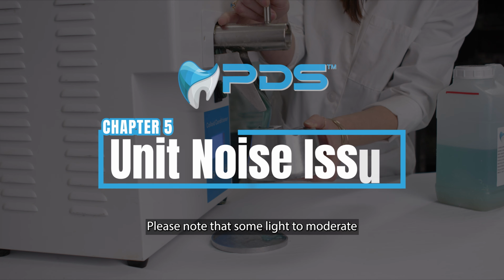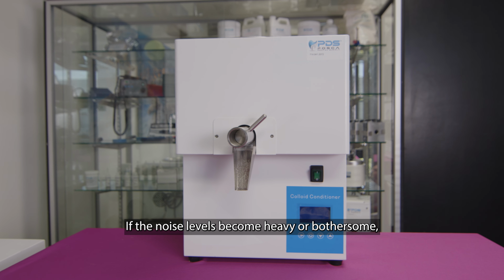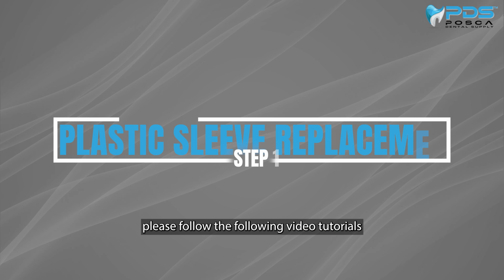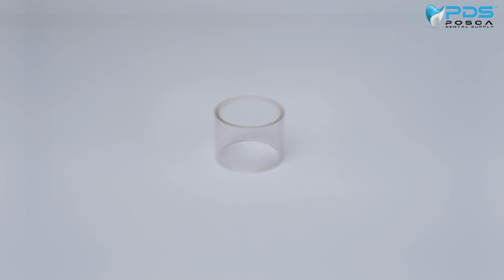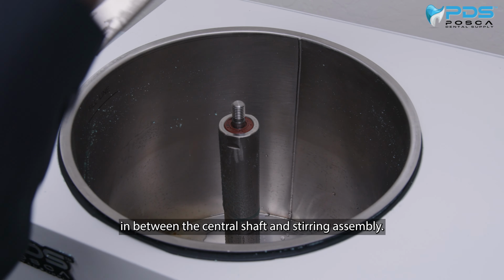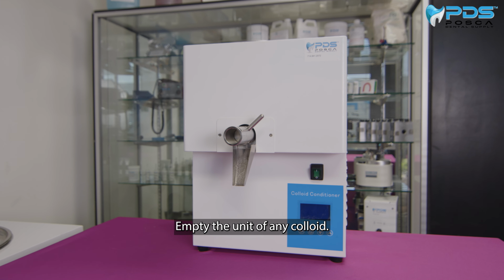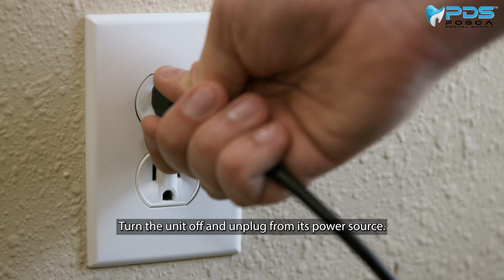Please note that some light to moderate noise is normal when the unit is running. If the noise levels become heavy or bothersome, please follow the following video tutorials to remedy the issue. The first line of action to remedy the noise issue is to check the plastic sleeve in between the central shaft and stirring assembly. Empty the unit of any colloid, turn the unit off and unplug from its power source.